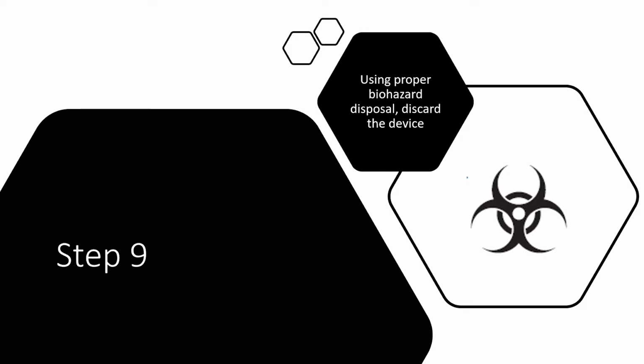Most of the samples that we're providing will be biohazard level 1 or 2. The list that we provide of potential microorganisms has some with higher biohazard levels. We won't be providing them, certainly not initially. The early stages of the program will be providing just biohazard level 1 and 2 samples.